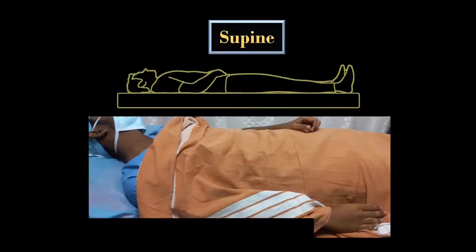The patient is placed in the supine position and the head is slightly turned away from the side to be blocked. The ipsilateral hand is placed by the side of the patient, or somebody can hold the hand with flexion at the elbow joint and away from the trunk. The hand should not be kept over the trunk, as shown in this picture. To know the reason, please continue watching this video.